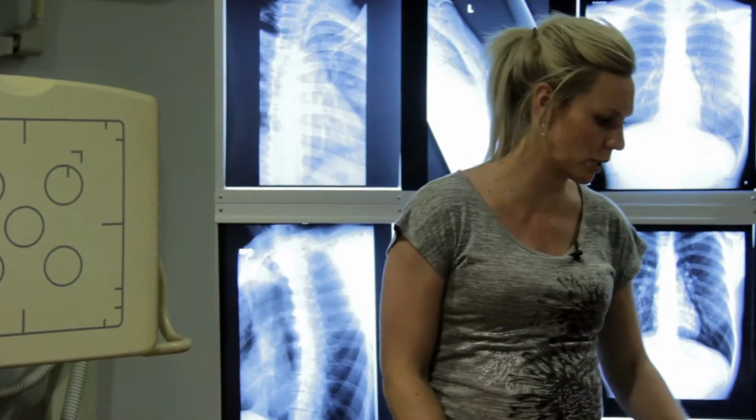Most of the ones I've looked at have been looking pretty good, so I don't foresee that being a huge issue. I mean, we obviously get patients sometimes that you just can't get through, but that was one question that had come up a little bit. Remember, 45 degrees is an average for your obliques, so that's also another consideration. Don't under rotate, evaluate the patient anatomy a bit.